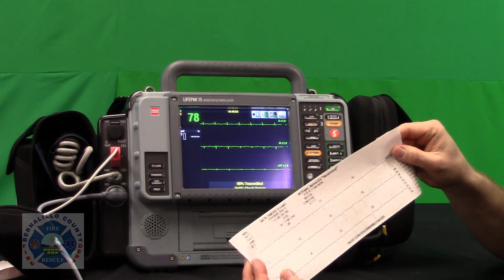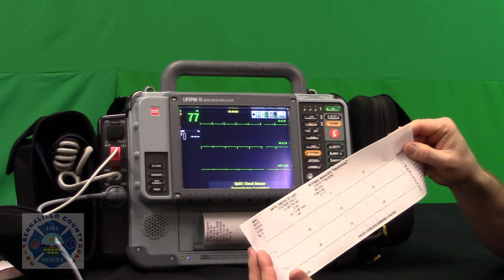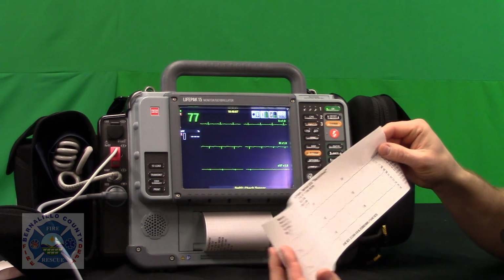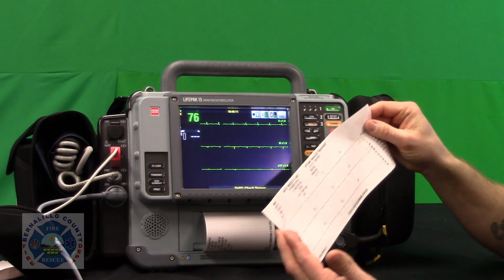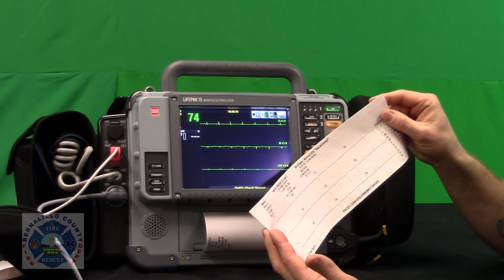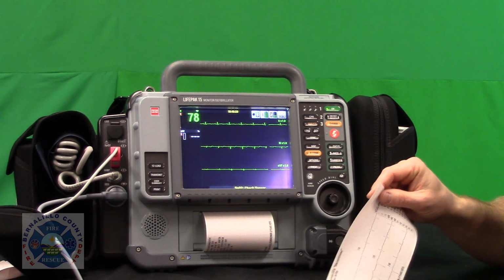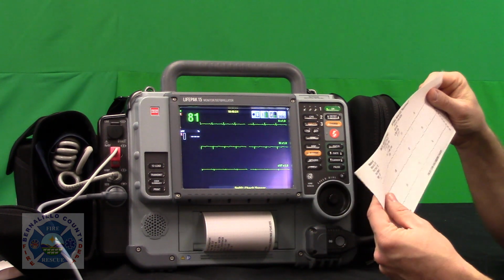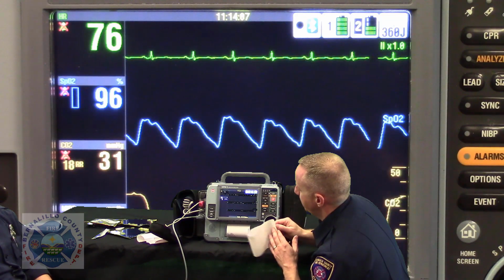Now, if you're receiving this at a hospital across town and you're not here on scene, you're going to see that as this prints out on my printer in the hospital, I go, oh look, I have a Vanessa Smith with a birth date and a gender and an age on here. I can look this patient up in my system and start getting the ball rolling towards the end game, which is to get them reperfused. So it's very, very important that we do that.